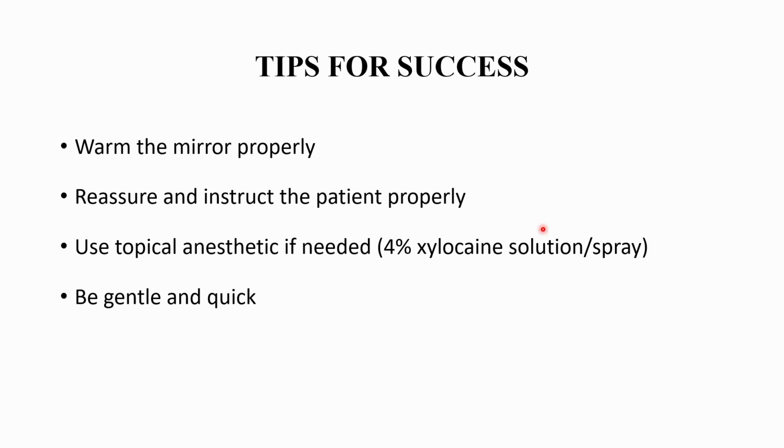Tips for success: warm the mirror properly, but before warming, explain the procedure properly to the patient. You have to tell the patient that you will be using a mirror to visualize the back side of the nose and nasopharyngeal area. To do that, you will heat the mirror slightly, but you will get it checked on the patient. It will not be too warm.